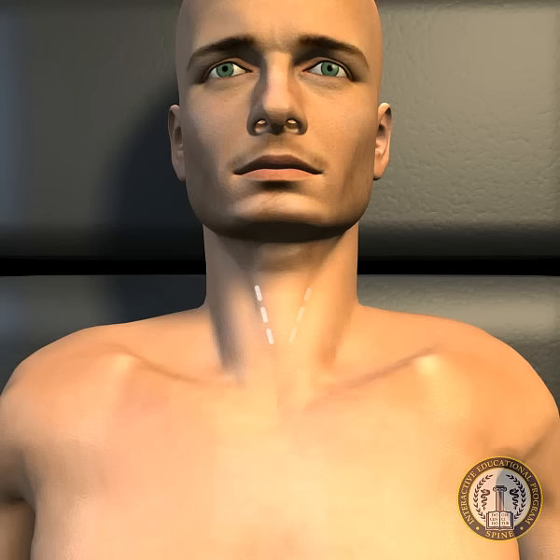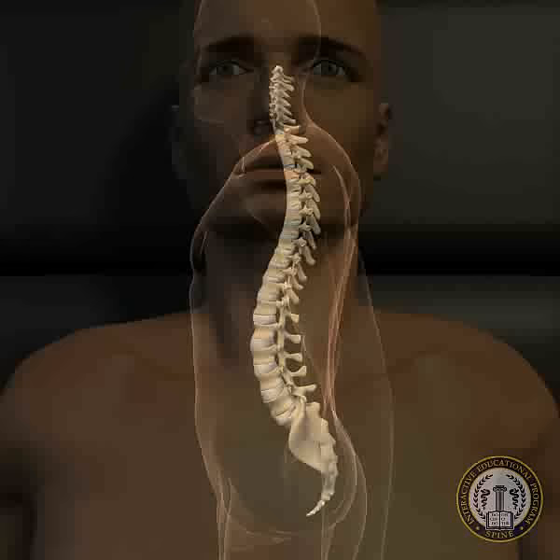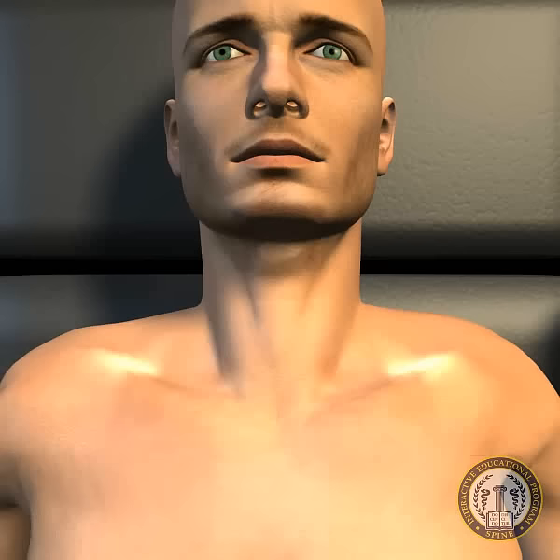Optimal positioning of the implant should reproduce the natural lordosis of the disc space to be replaced. To achieve this, gentle extension of the neck with a roll underneath the shoulders is performed.